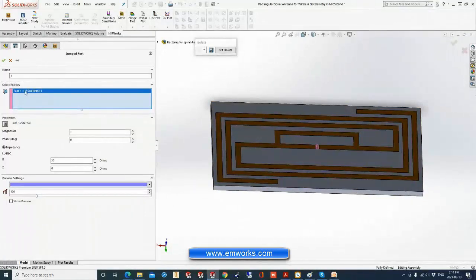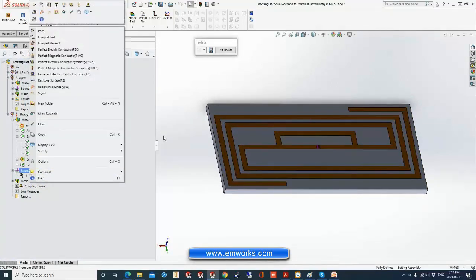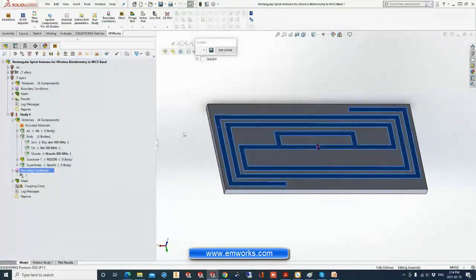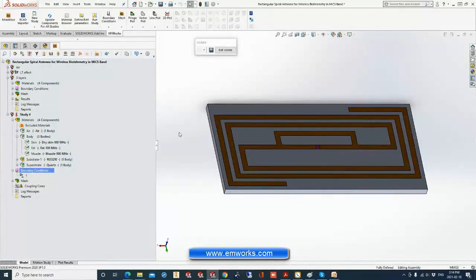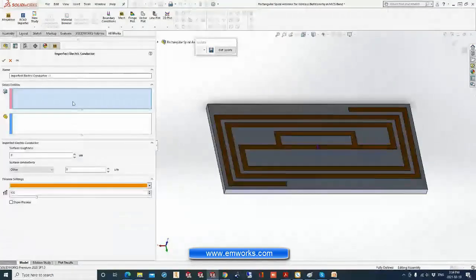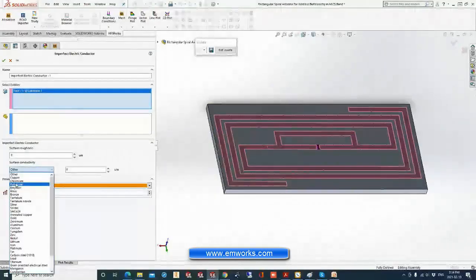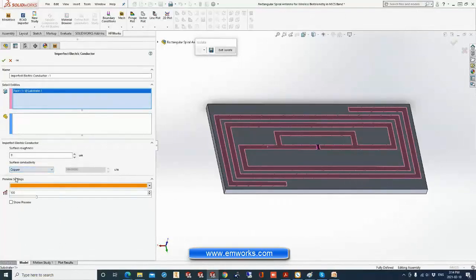So this is the port. It is an internal port because it's inside the computation domain, inside the air, and we defined here a 50 ohm port. For the conductors, because we created split lines here, and there is no skin effect at this frequency, you simply have to define an imperfect conductor on the face of the trace on the substrate, and we choose a material with a certain conductivity. For example, copper, and we can also add some roughness.